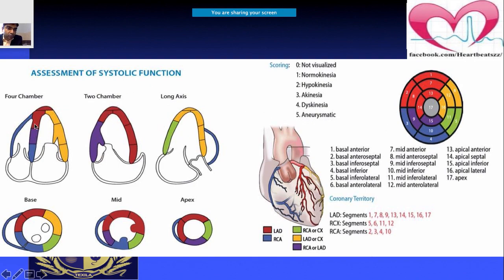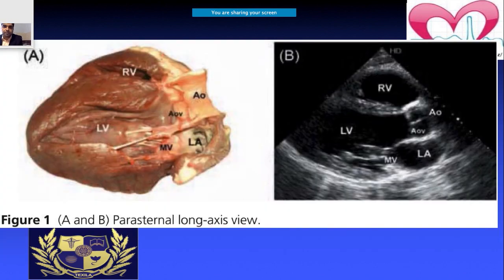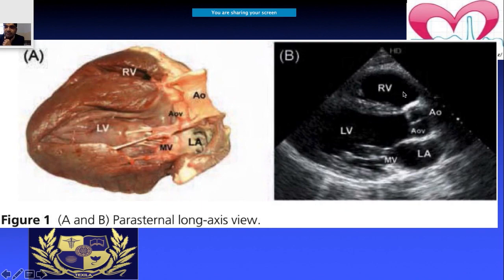You can correlate which walls are visualized in which views with the associated coronary artery territory. This allows you to state which coronary artery territories are possibly affected. In the parasternal long axis view, you visualize the left atrium, left ventricle, aorta, aortic valve, and right ventricle — seeing both the mitral and aortic valves.